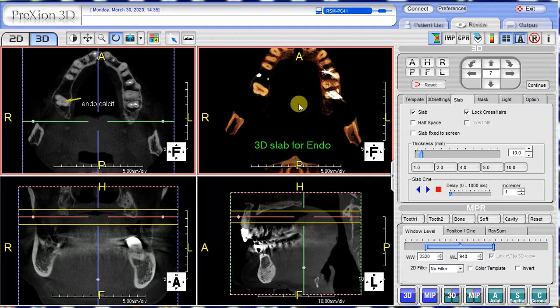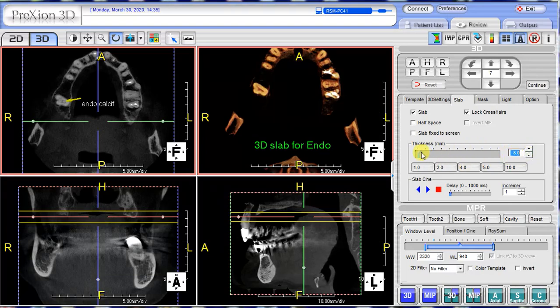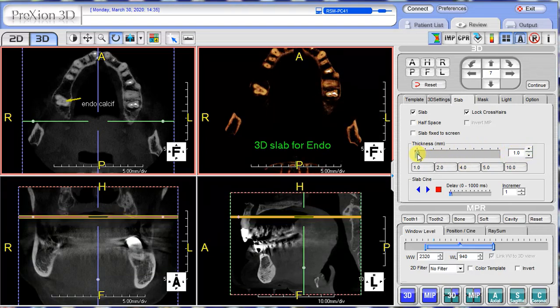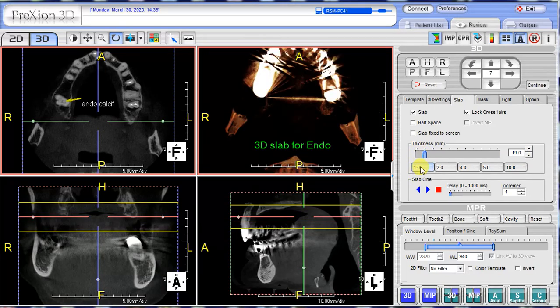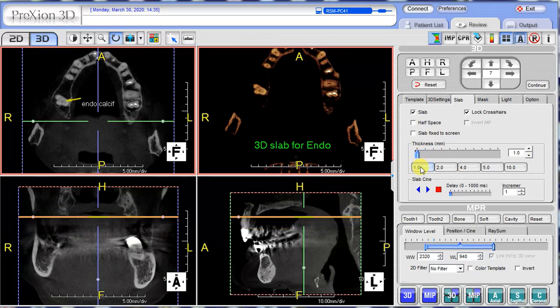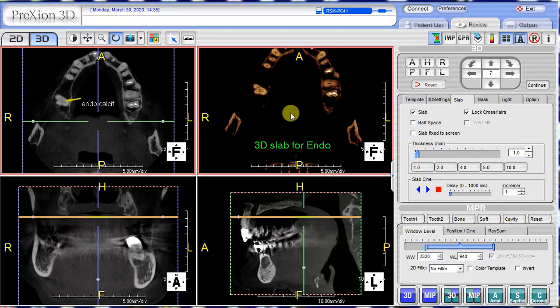The thickness usually comes out to a 10mm slice thickness, but we want to take this down to 1. You can do it a number of ways: arrow down, bring the blue tab arrow over, or simply click the number 1 box — the simplest way to do that. The slice thickness is now at its lowest for the slab, which is 1mm.